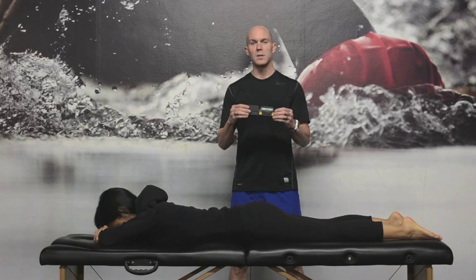What I'm holding here is a digital grade inclinometer, and this is something I use to record a lot of my range of motion measurements. I'm going to show you a non-weight-bearing assessment of ankle dorsiflexion. This gets soleus extensibility as well as general ankle mobility from a capsular standpoint.